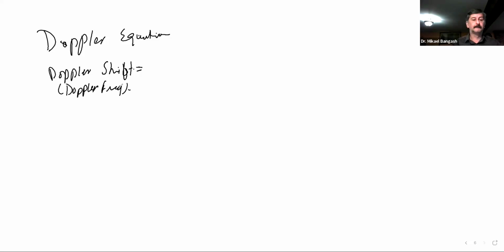Did you guys get that? And what was it that this basically was? That's just the difference between the reflected frequency and the transmitted frequency, or the transducer's frequency.